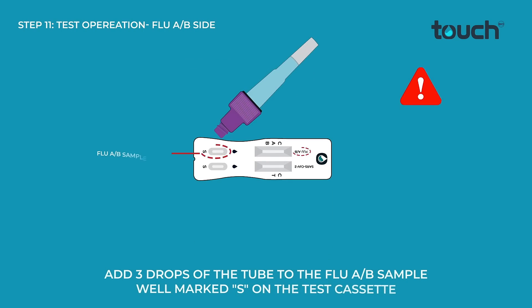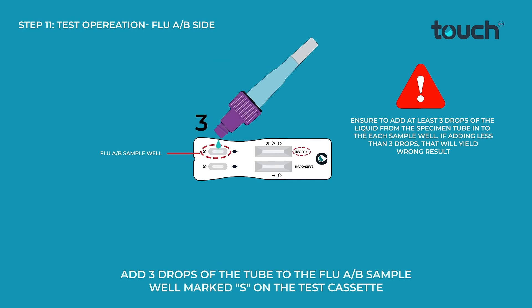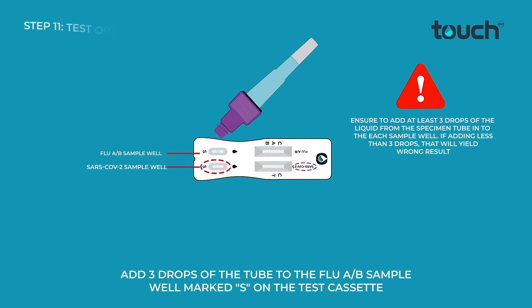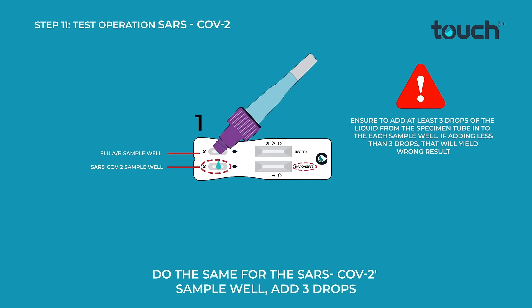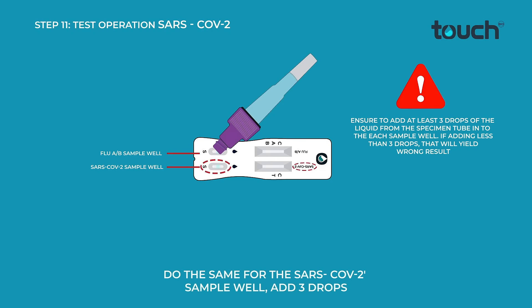Add 3 drops of the tube to the Flu A/B sample well marked S on the test cassette. Do the same for the SARS-CoV-2 sample well — add 3 drops.